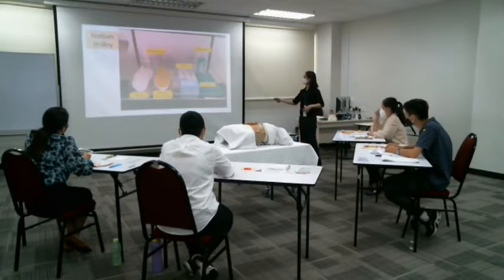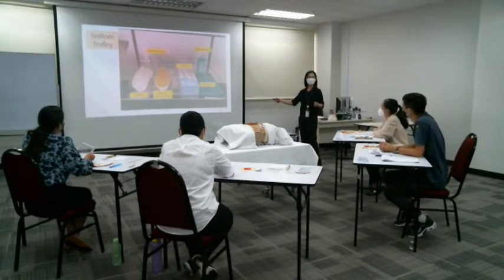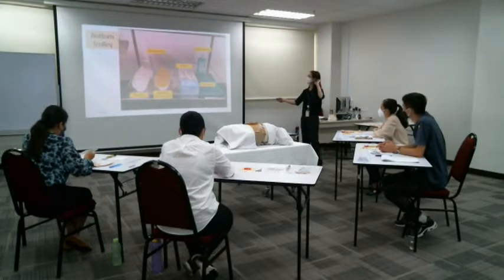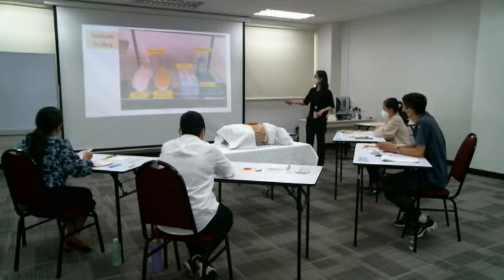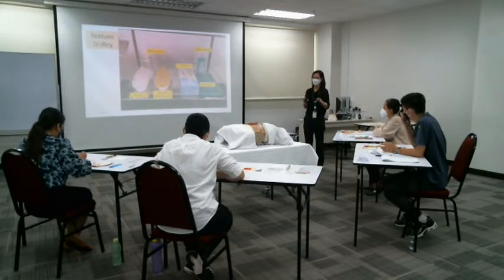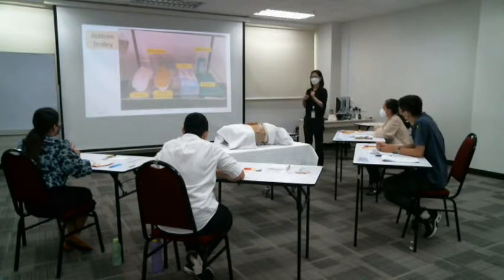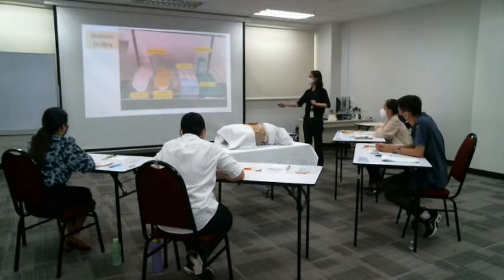The bottom trolley you have measuring jar because you need to measure the output, especially if this is ileostomy, ascending colostomy, right? So it is very watery, the output, so you need to measure. And an ordinary receiver, for you to receive, let's say I am changing the bag only, I don't change the base plate for two-piece system. So this one I'm taking and putting it here. Later I bring to toilet to wash the bag. So to differentiate from another receiver, which is for clinical waste and to throw it away. This one you don't want to throw.